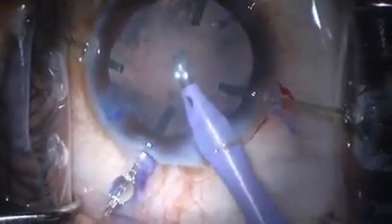and Dr. Rick did just a wonderful job of getting rid of the nucleus, and now we've got some cortical material. You can see the zonules are still pretty weak, especially in that one area there. And so we avoid that temporarily. We're going to place a capsular tension ring, and we'll get to that later.